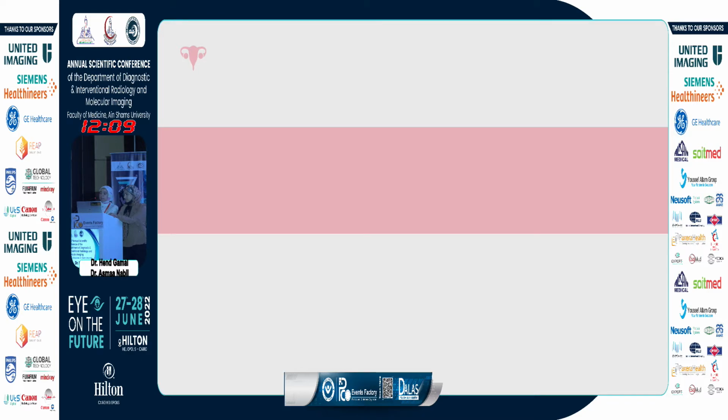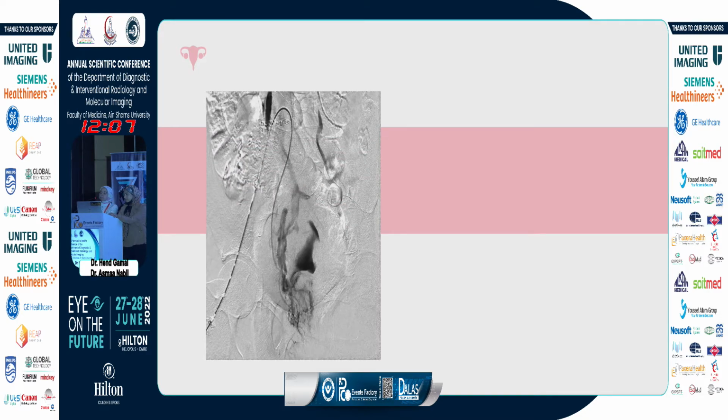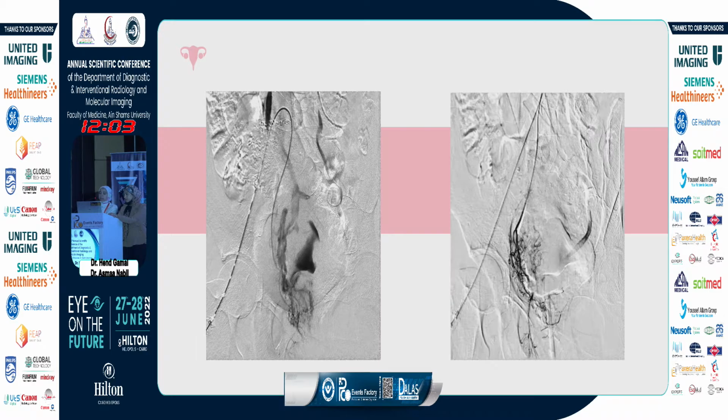Catheterization of a cervical branch was done and revealed marked contrast extravasation. Embolization by gel foam also was done, and the control image showed no contrast extravasation. In this case, we need to highlight that we need to catheterize all the branches that may represent a source of bleeding to fully control the source of bleeding.